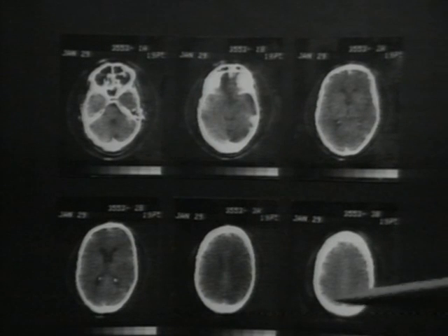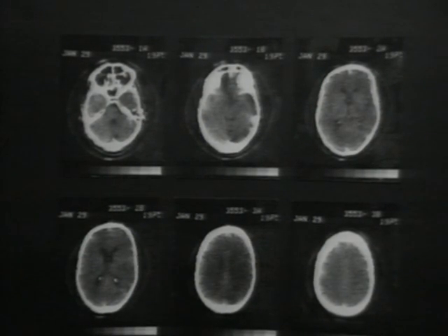In these scans, unless there is an abnormality present, we can't really distinguish cortex from white matter. But if there is edema, or if the patient has cerebral atrophy causing widening of the cerebral sulci, we can distinguish these structures. Now, let's consider the abnormal scan.